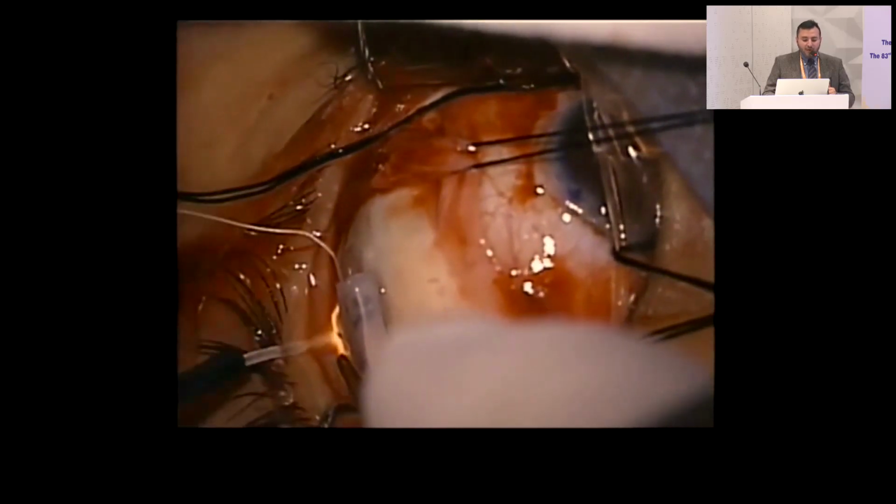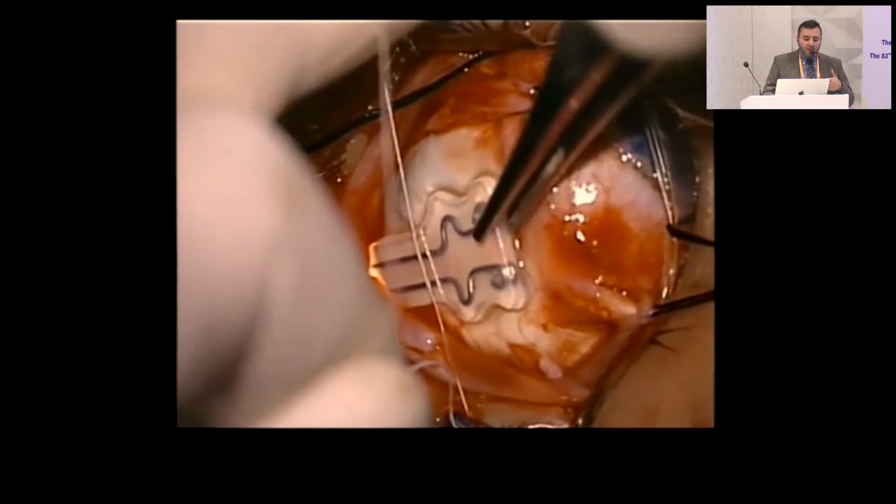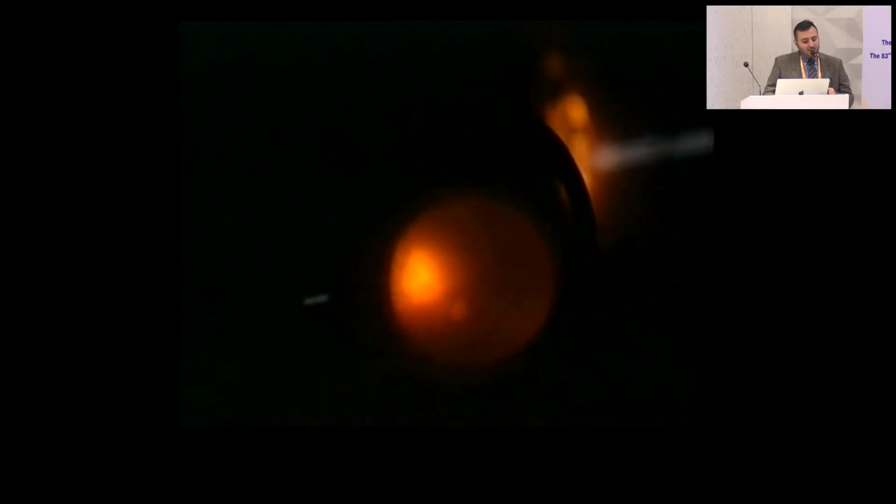Putting the plumb like that and entering, seeing through the indirect ophthalmoscope or even the microscope, the indentation light, as we are going to see in this video, and putting the indentation light at the proper area, which is at the macular hole, myopic macular hole, to buckle this myopic macular hole and to configure the posterior aspect of the globe.